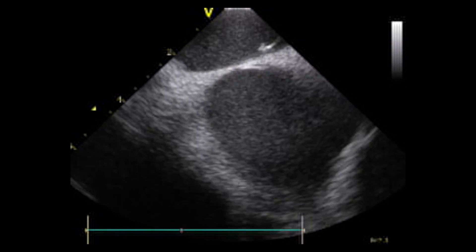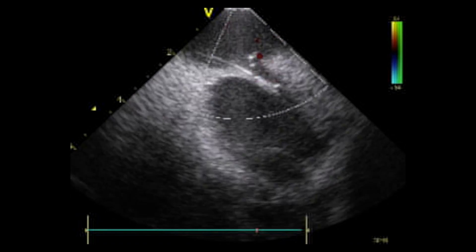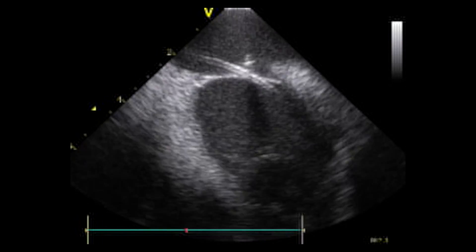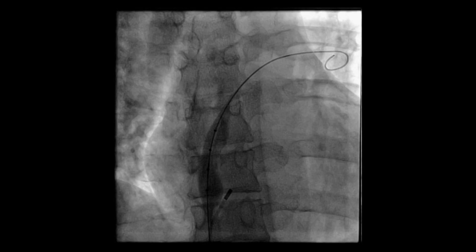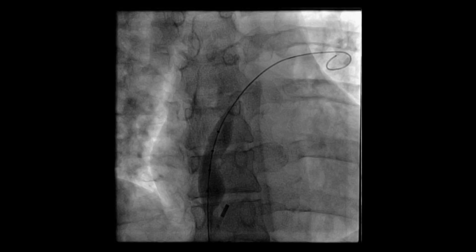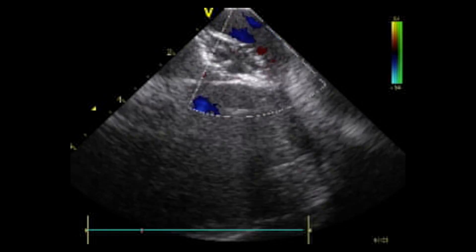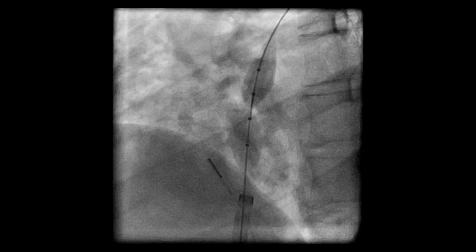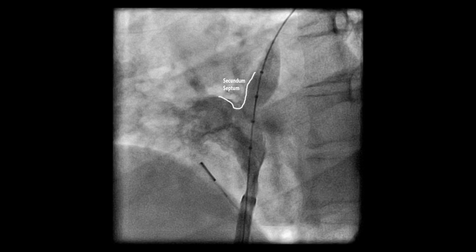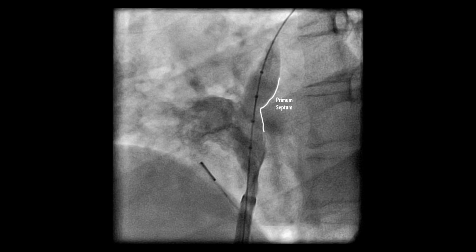Remodeling the atrial septal aneurysm allowed the placement of an O32 wire through the patent foramen ovale. The wire is advanced through the upper pulmonary vein, giving us a track to run the Noble Stitch EL. A sizing balloon is placed over the O32 wire and through the PFO tunnel. The sizing balloon will allow us to determine the diameter of the PFO tunnel. Additionally, we will be able to see the septum secundum and identify the margin of the septum primum, as shown here by angiographic control.